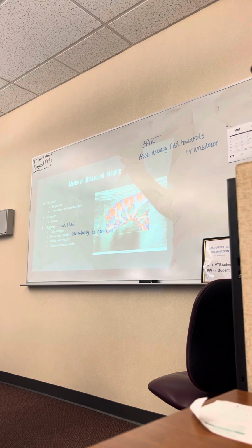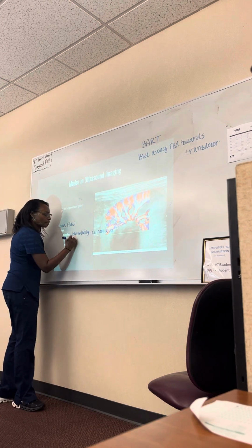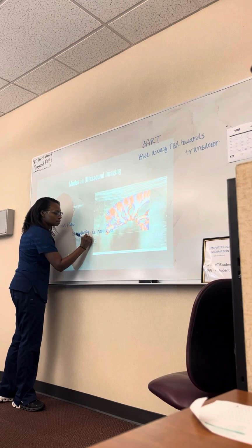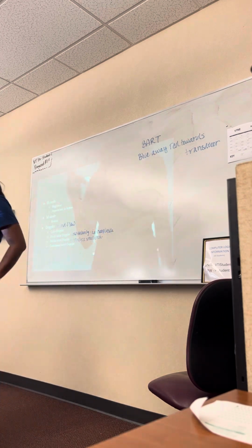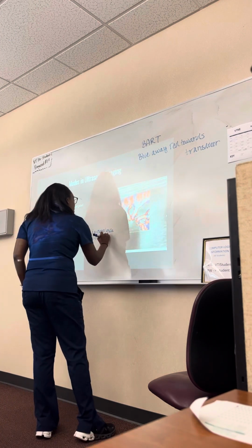All right. The next one, pulse wave Doppler. This is used to analyze a very small area. All right, typically we're talking about peripheral vessels, and we're looking at the velocities of peripheral vessels.